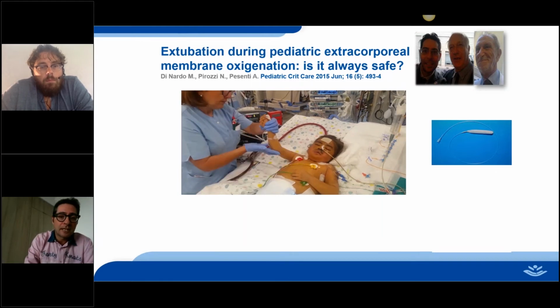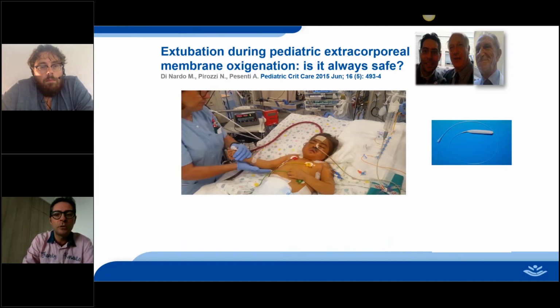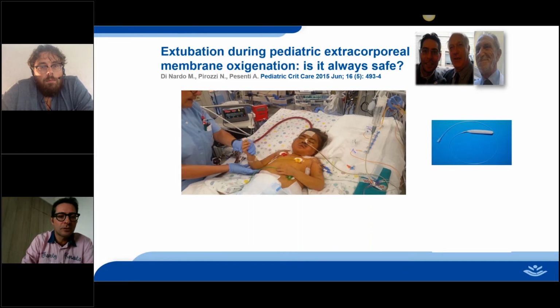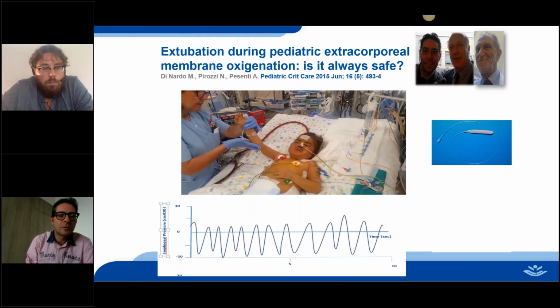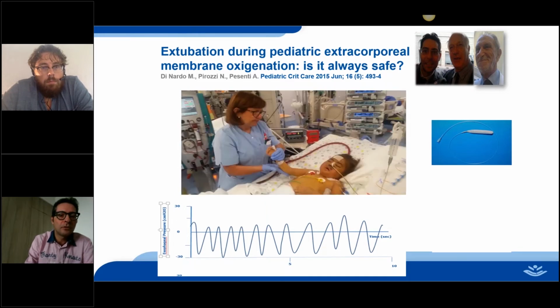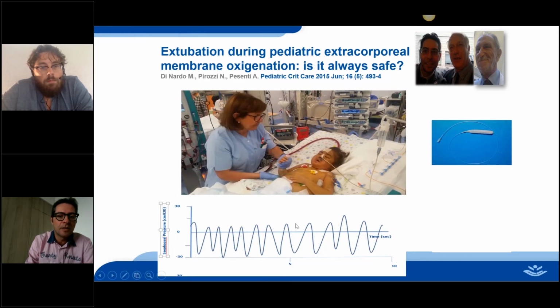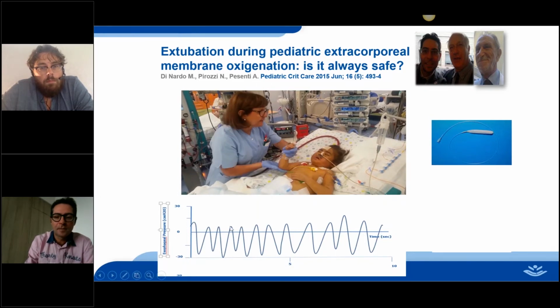What we found in a situation like this one, early ARDS, awake patients, fully supported with good gas exchange, is this situation here: completely dangerous swings of the pleural pressure that furthermore are not orderly in time. See here there are differences in time, so there is a complete asynchrony.